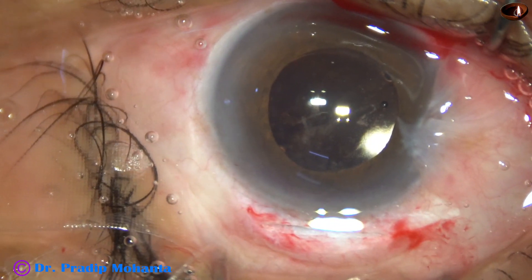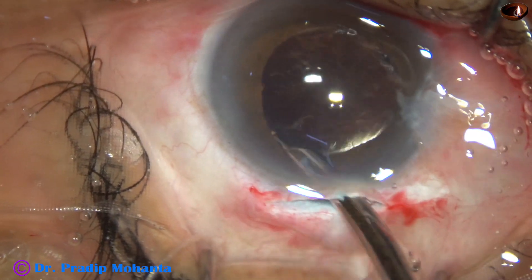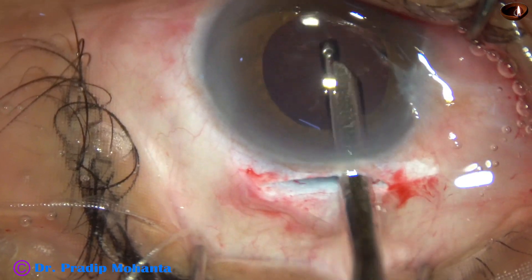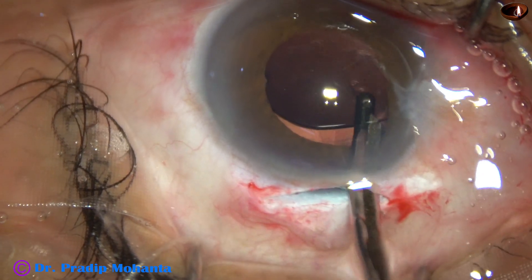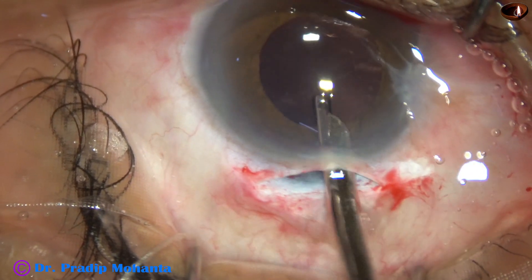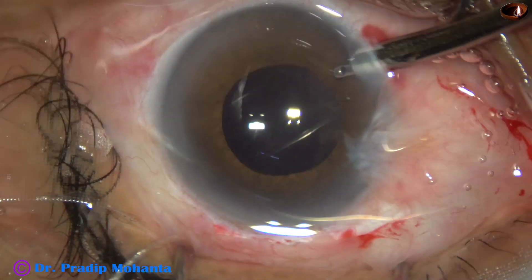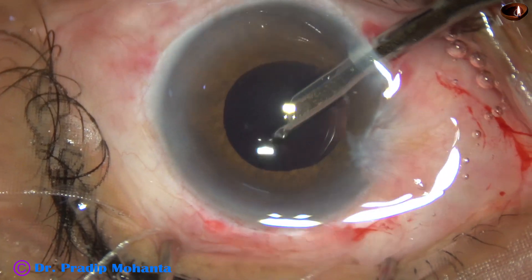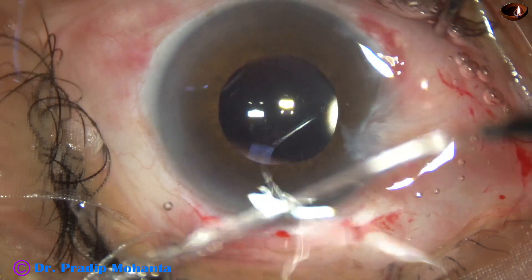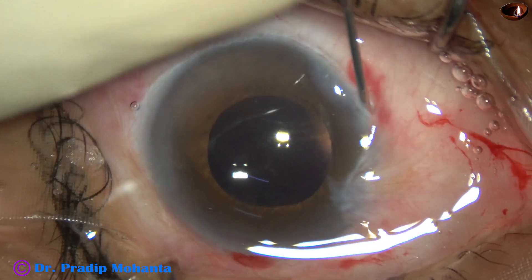The lens goes into the capsular bag. Now I use a 22-gauge Simcoe to remove the visco from the anterior chamber as well as from the capsular bag. Very nice cleaning of visco is necessary. Go through the side port again and irrigate and aspirate the visco until it is nicely done.